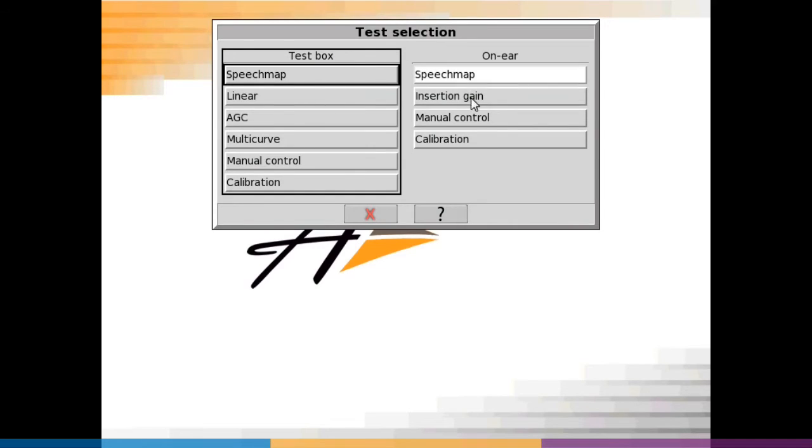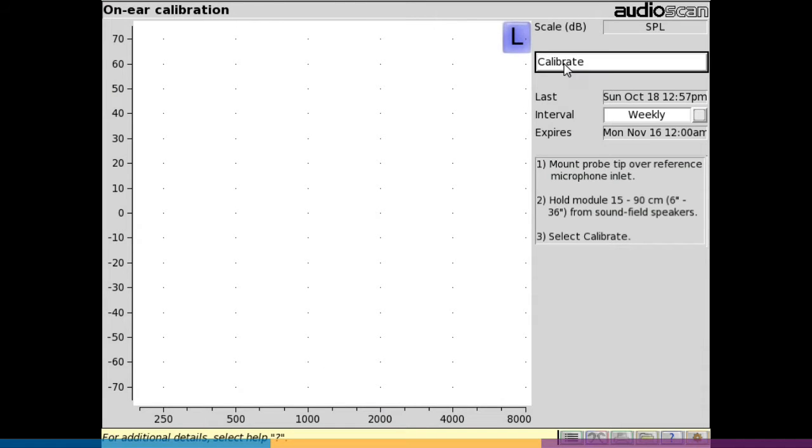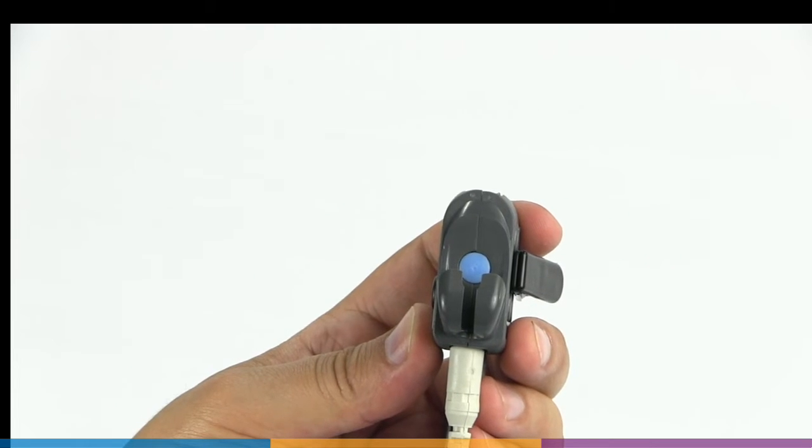Select the on-screen calibrate button for the probe mic you are calibrating. On Verifit 2, the probe dock is designed to hold the microphones during calibration.